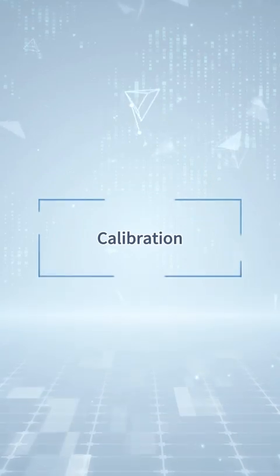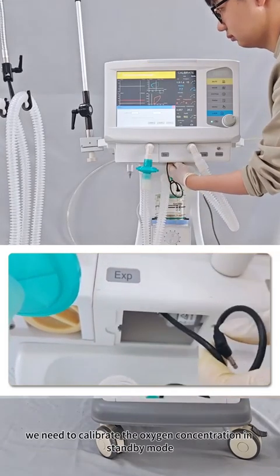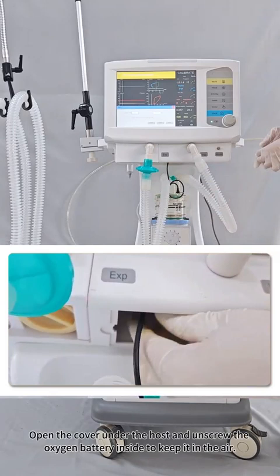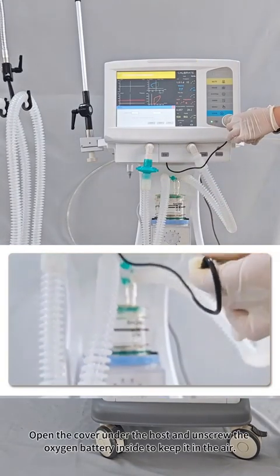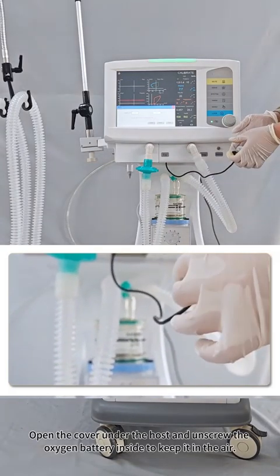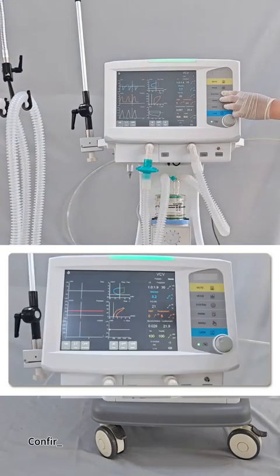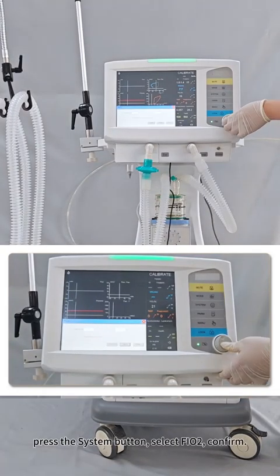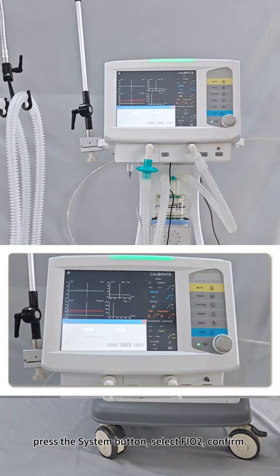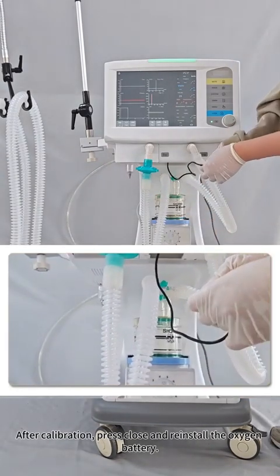Calibration. Before other operations, we need to calibrate the oxygen concentration in standby mode. Open the cover under the host and unscrew the oxygen battery inside to keep it in the air. Confirm the ventilator is in standby mode, press the system button, select FiO2, confirm. After calibration, press close and reinstall the oxygen battery.